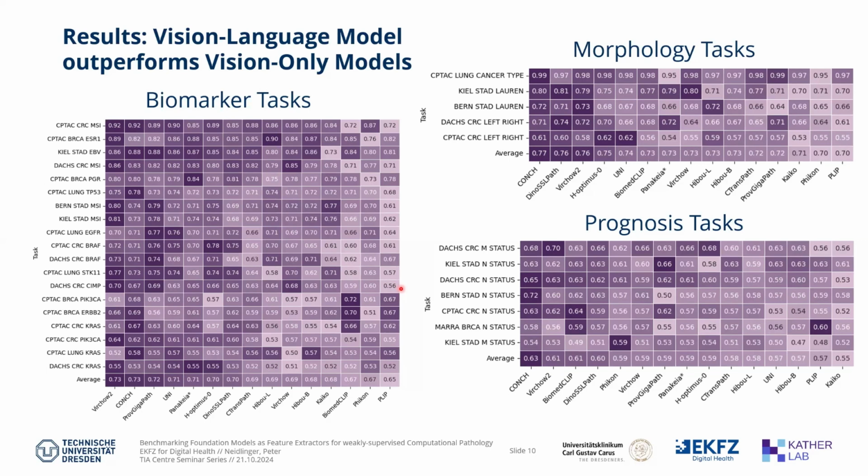And you also reported results regarding the prognosis experiments in the same table, right? How did you do these prognosis tasks? Is it like a classification? Yeah, sorry, I didn't mention that. It's only N0 versus N plus. So basically, either the lymph node is not affected, or any N plus, N1, 2, and so on, meaning there is some kind of lymph node metastases. And for M status, it's M0, so no distant metastases, or M plus. I see, makes sense. All right, thank you.